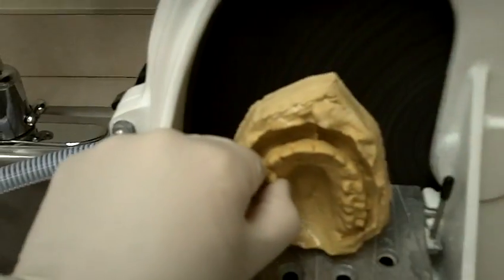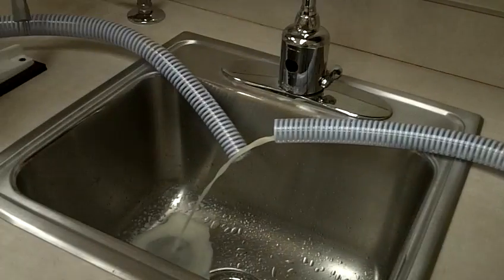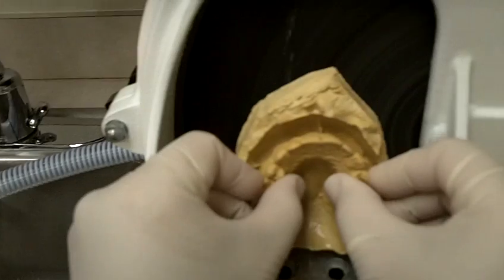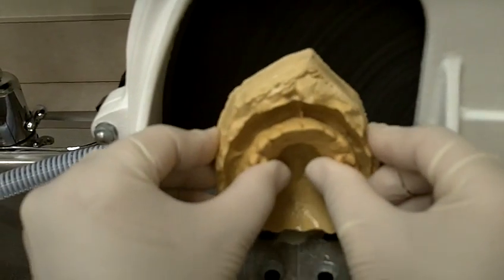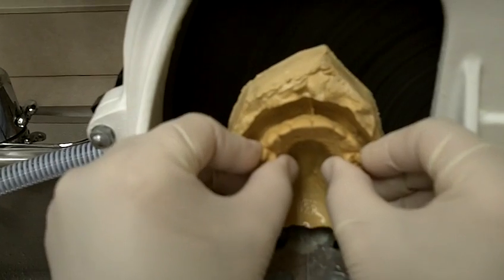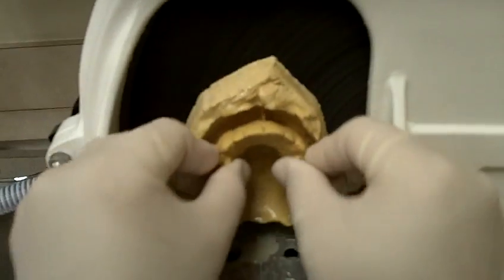You want to put some pressure on it. Okay, you adjust the water if you need some more. Notice the water is coming out there. You want to always hold your model from here. You don't want to hold it too close to the ends when you go into this. Okay? But you want to hold it tight because you don't want it to flip out at you.